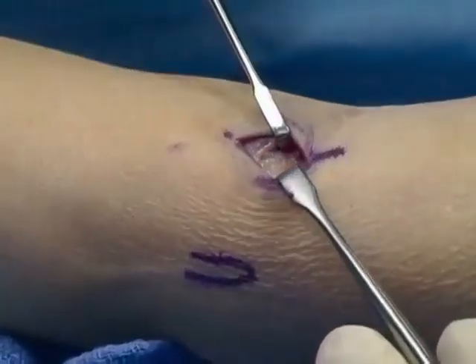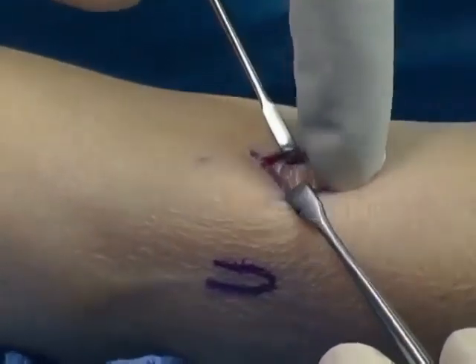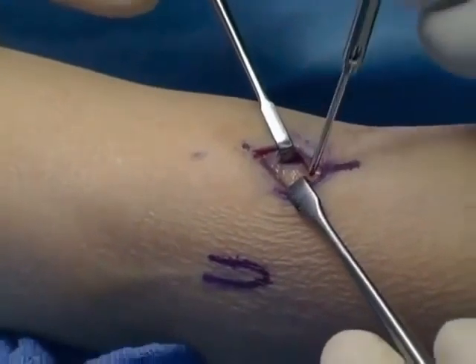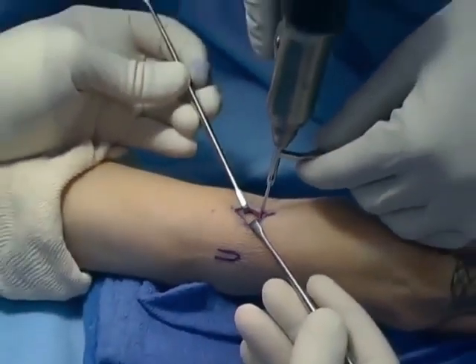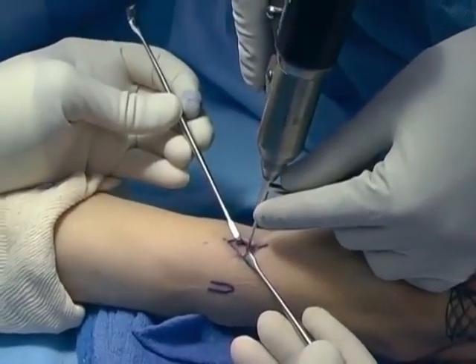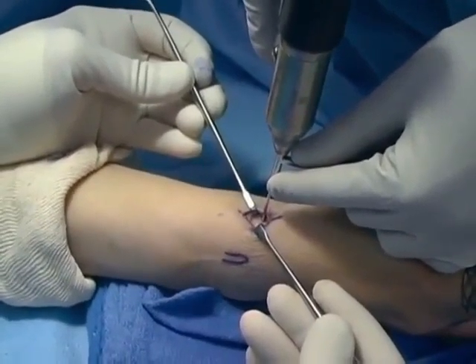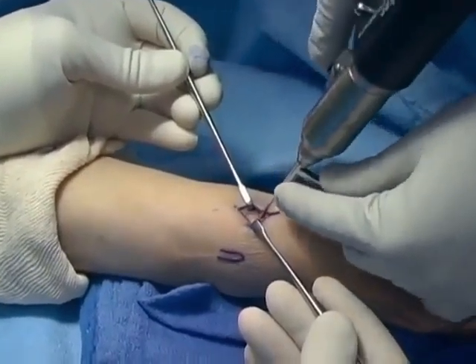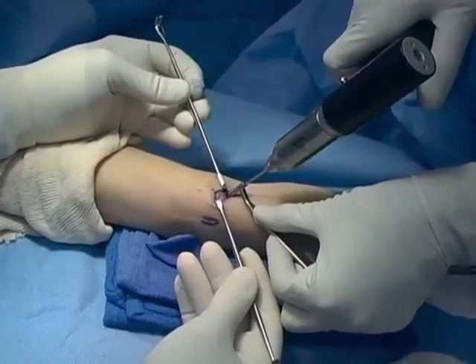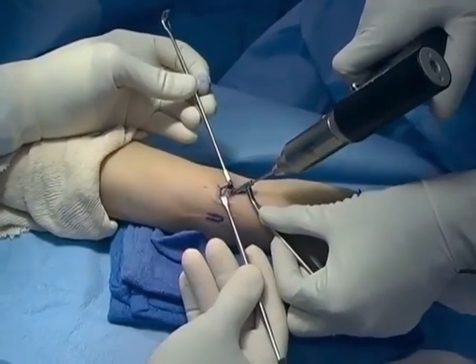The pins are always placed using a tissue protector in order to not wrap up the radial nerve. Here the pin is placed at the tip of the radial styloid; the tissue protector is placed on the bone and the pin is placed into the distal fracture fragment, not across the fracture.